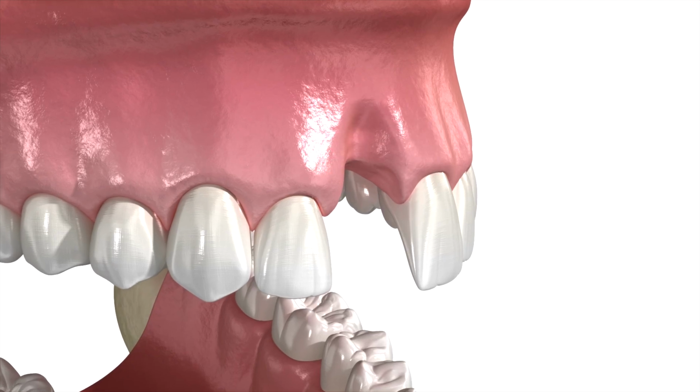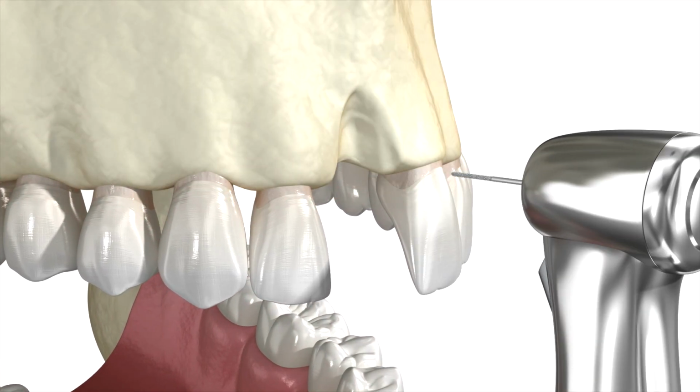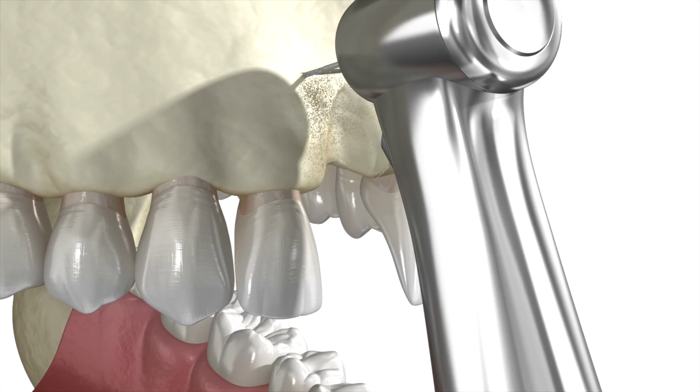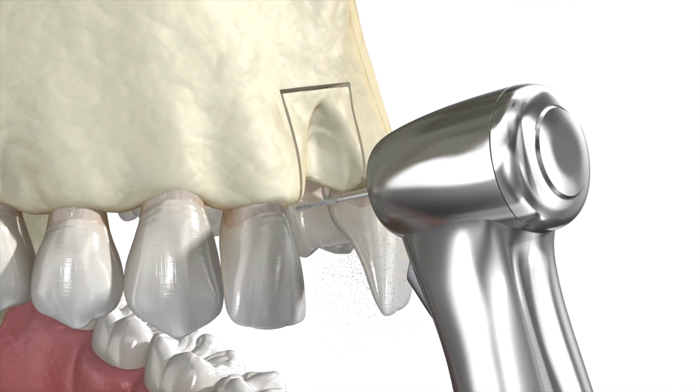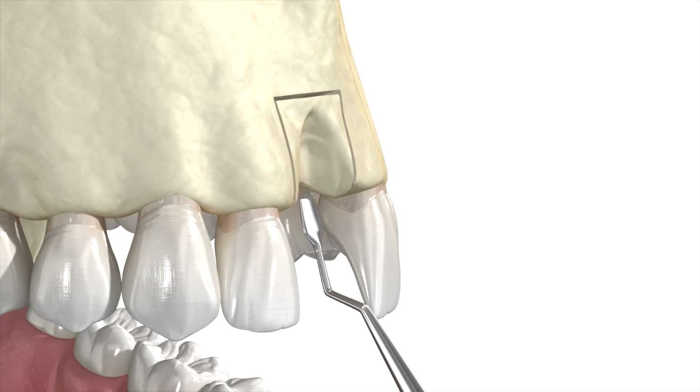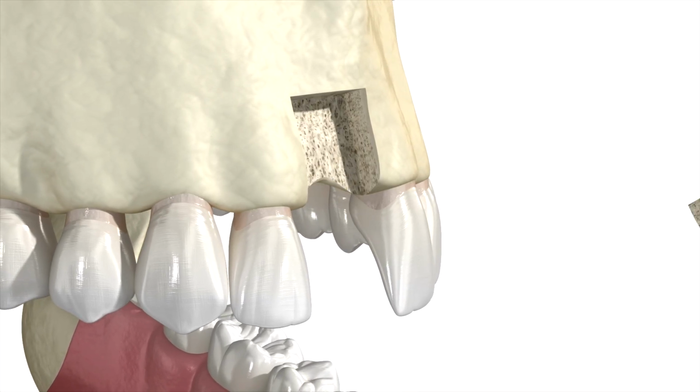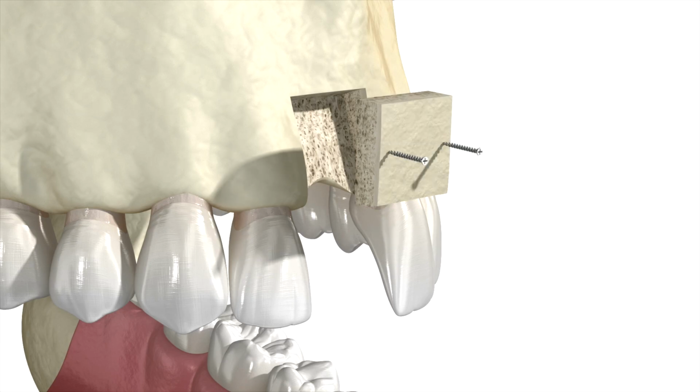To prevent all the complications we've discussed, sinus perforation, nerve injury, insufficient bone height, incorrect drilling protocol, or unrecognized anatomical variations, the surgeon must rely on 3D cone beam computed tomography, or CBCT. CBCT is the gold standard.